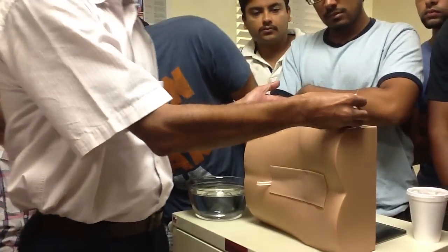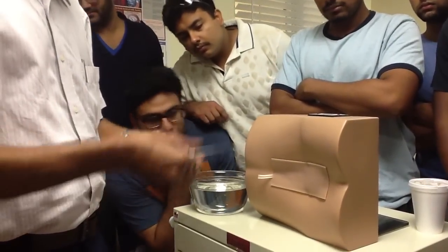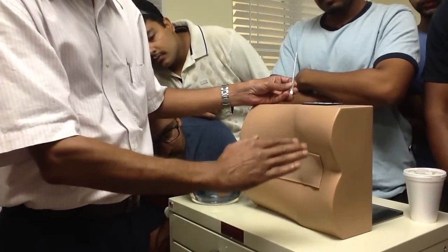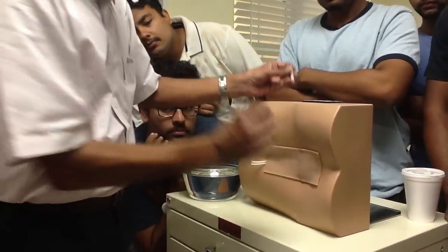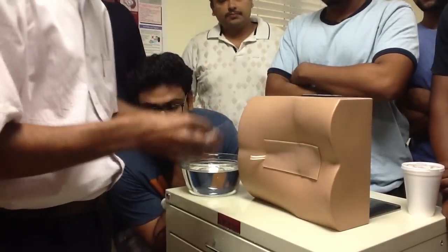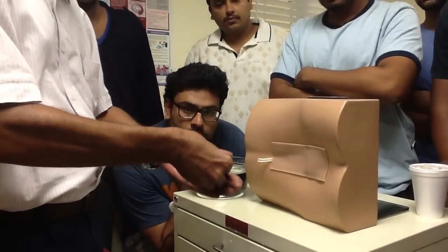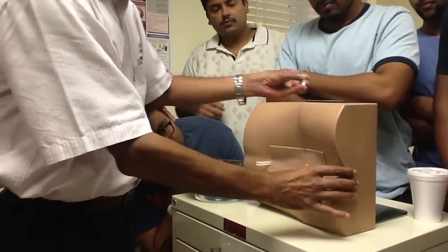Now the procedure. The patient is in the left lateral decubitus position. We have assumed that we have already painted with povidone iodine and alcohol, put a drape with a central hole, put on gloves, and infiltrated local anesthesia. So these steps have been taken care of. We are not supposed to touch the needle shaft. This is how I'm going to be holding it. We have already felt the spaces.